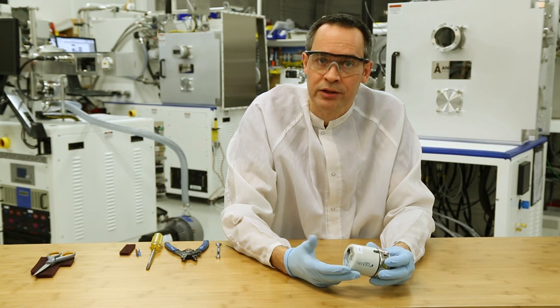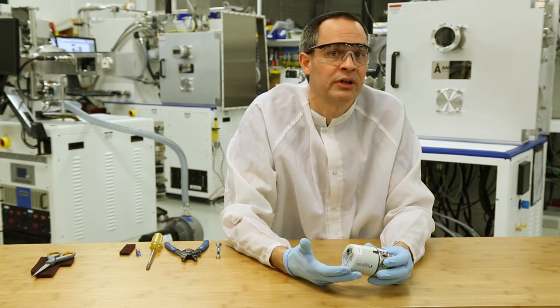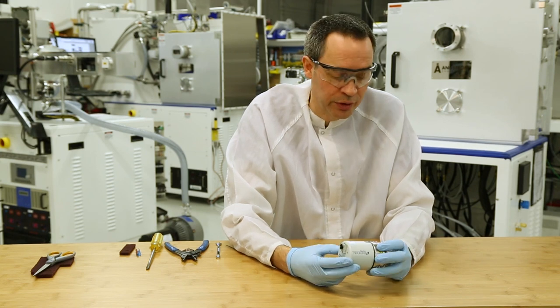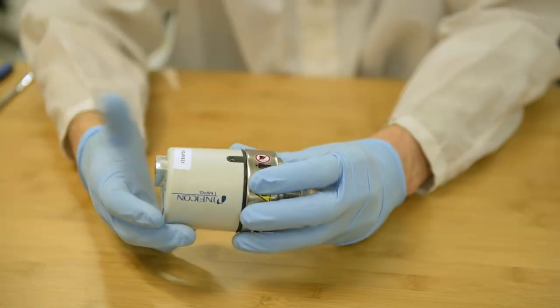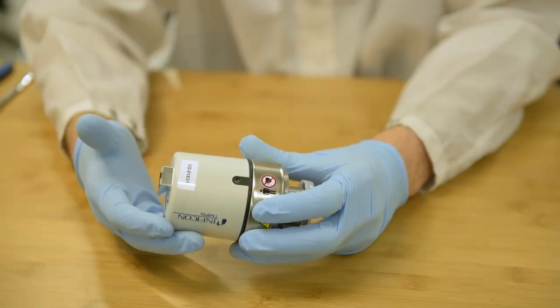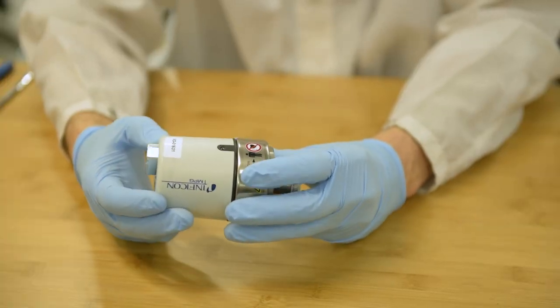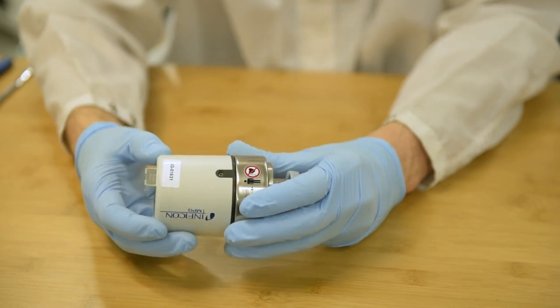Typically we can restore the gauge functionality simply by doing what we classify as a quick clean, and that's what we're going to demonstrate today. We're going to simply take it apart, clean the chamber and put it back together again, and in most cases we find that this will restore the gauge functionality.